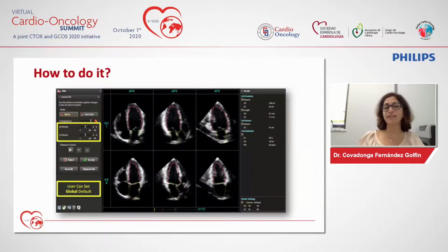And for the analysis, just click the button, and you will get these kinds of images with the end-diastolic phase and systolic phase, with the orientation and the segmentation. If you agree, you just press accept and you get your results. But you can do some editing in case you don't agree. You will have the volumes, the ejection fraction, and also the left atrium volumes and ejection fraction, that we haven't talked too much about, just by a simple click.